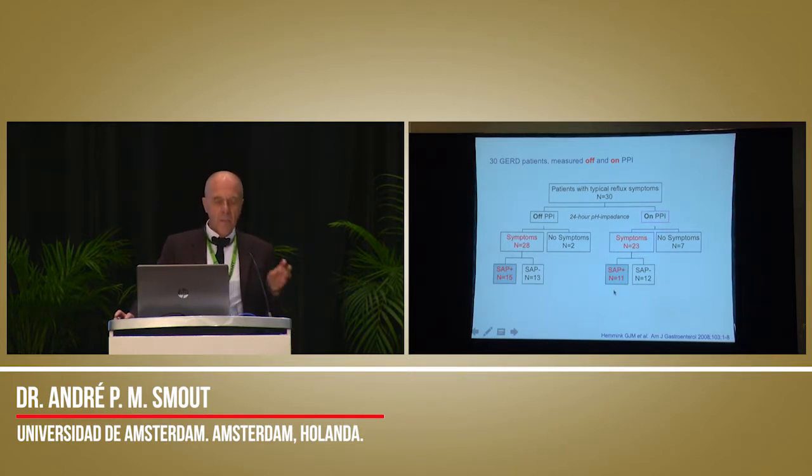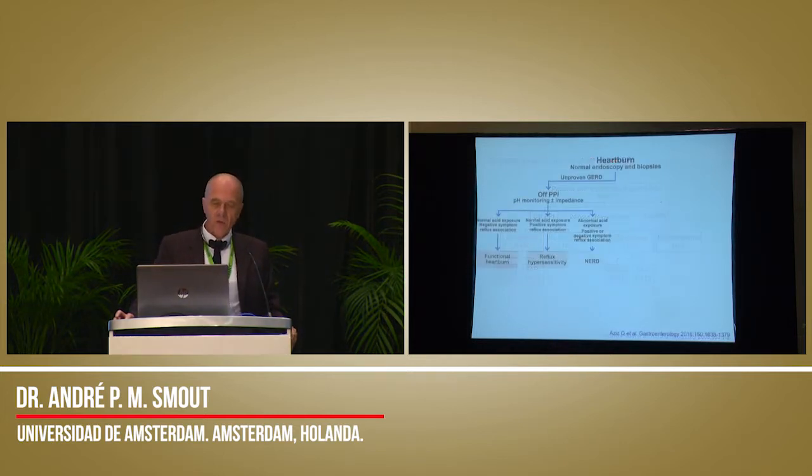This means the chance that you can prove that the patient's symptoms are truly based on GERD is higher when you measure off PPI.